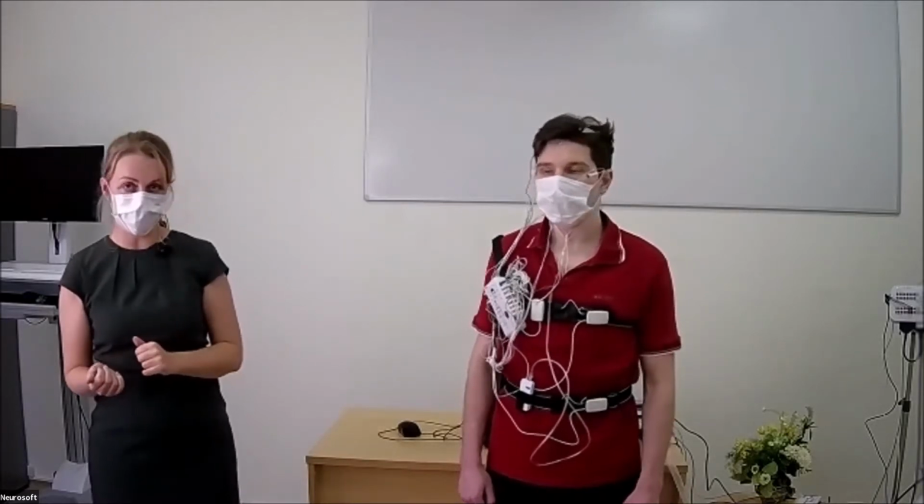Why do we need 6 derivations if 3 EEG derivations are enough for sleep staging? We put backup electrodes in case the main electrode fails or malfunctions, because it's very important to have information from the frontal, central, and occipital areas. And if some electrode from this area fails, we don't get the information which is necessary for sleep staging. So we put 6 EEG derivations: 3 main EEG derivations and the backup derivations.